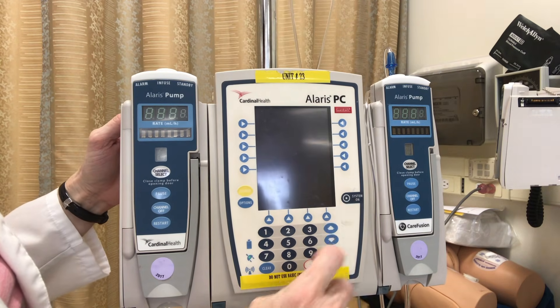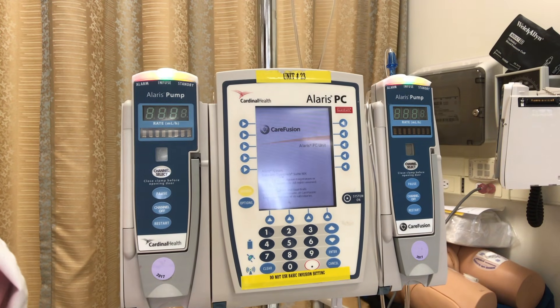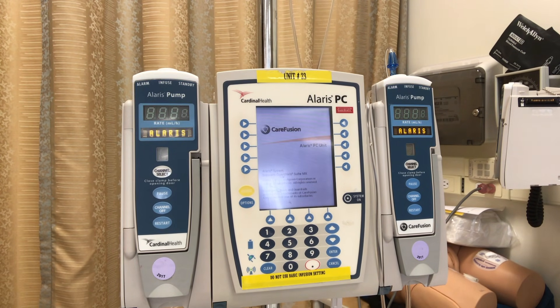Let's get started and turn this baby on. The Alaris pump will do some system checks before we can program anything in here for our patient, and for demonstration purposes I've chosen to have two channels already attached to the pump.